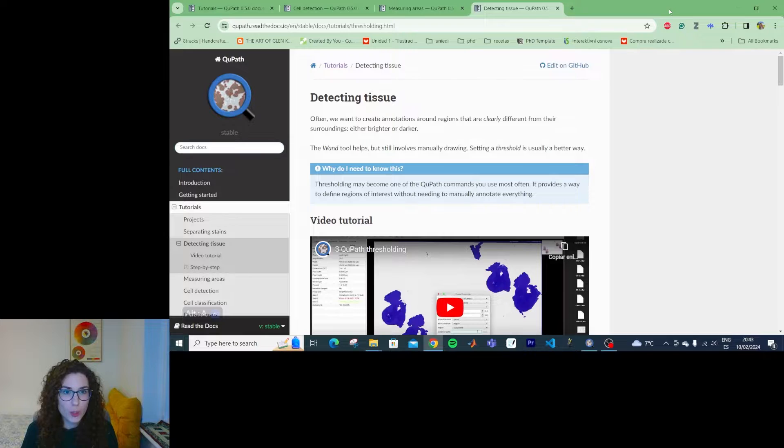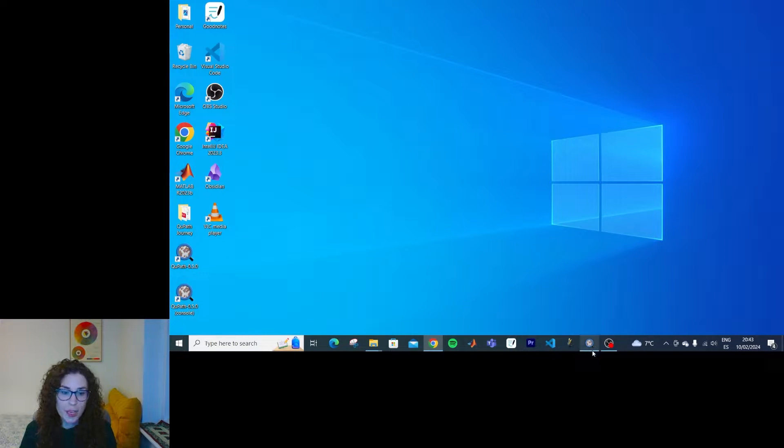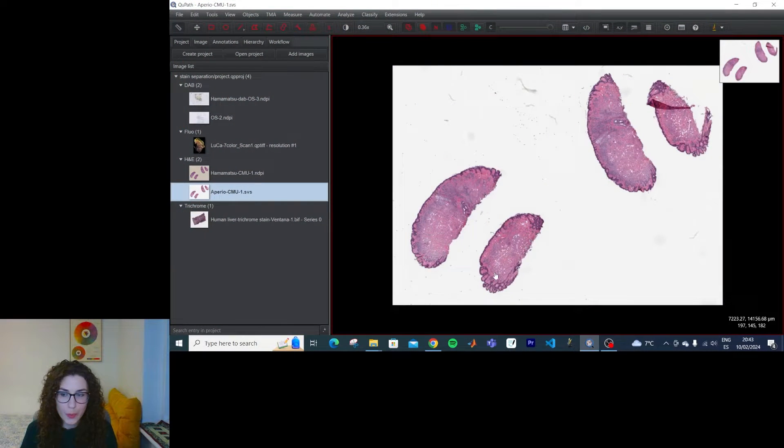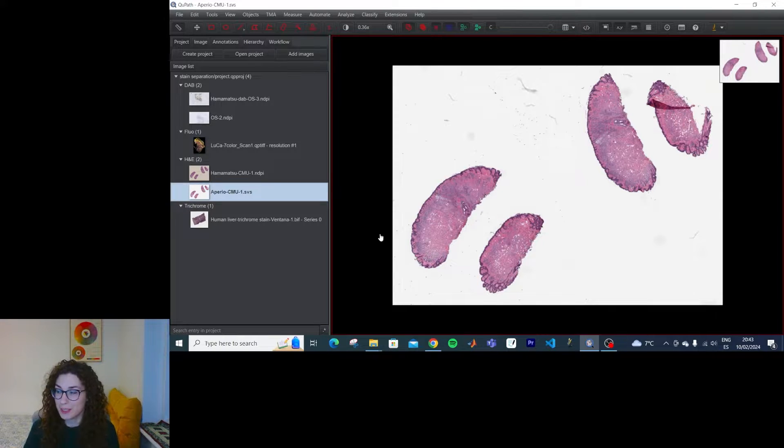So as before I'm going to pop this to my other monitor, open up QPath, and try this out in different images.